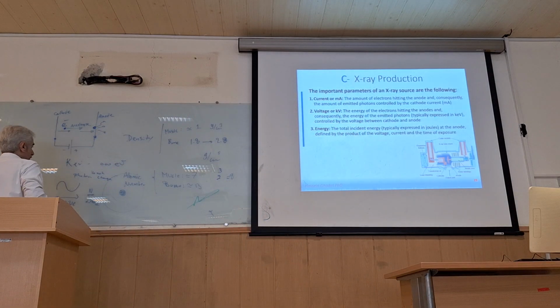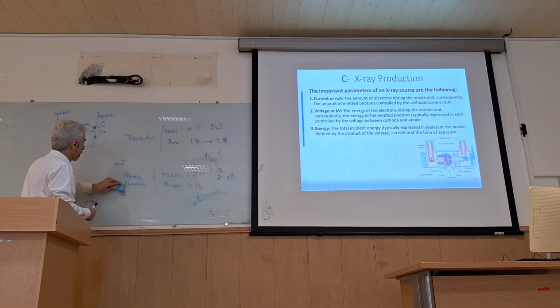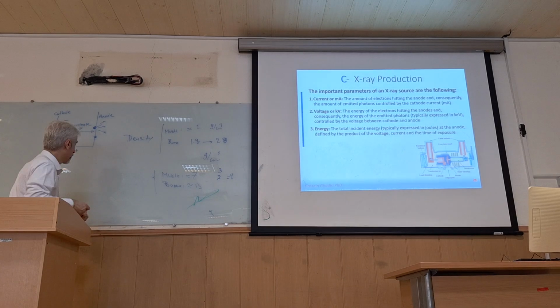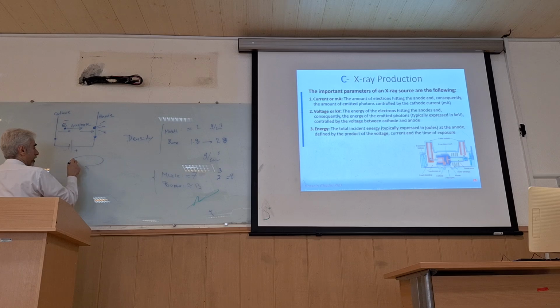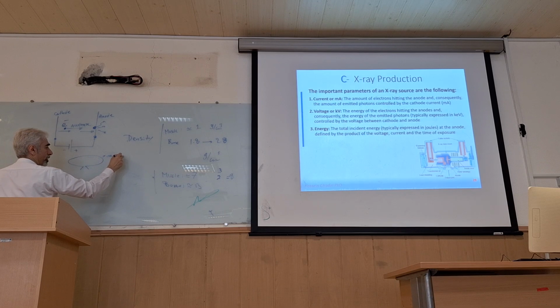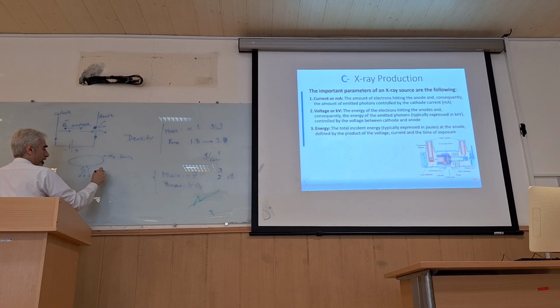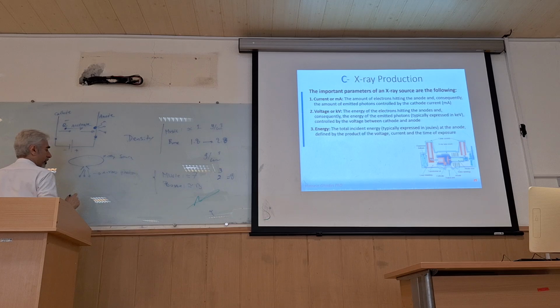For example, let's compare these two conditions. This is the X-ray source. It gives us X-ray photons that come out.